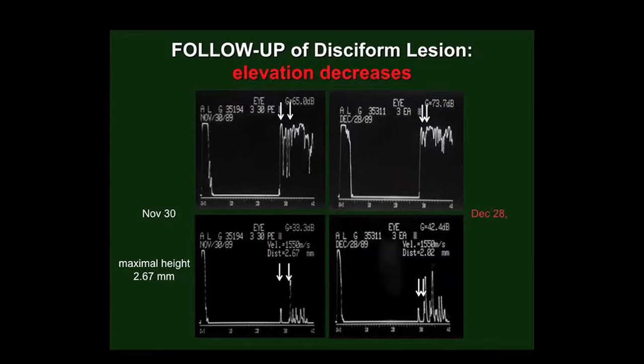This is important not only for the specialist who gets referrals, but for the general ophthalmologist. The general ophthalmologist needs standardized echography even more so, because when there is no way to arrive at a diagnosis from the symptoms or the optical examination, the general ophthalmologist needs to make a decision whether to triage, to send to specialists, or to keep the patient and treat the patient and manage the disease themselves.